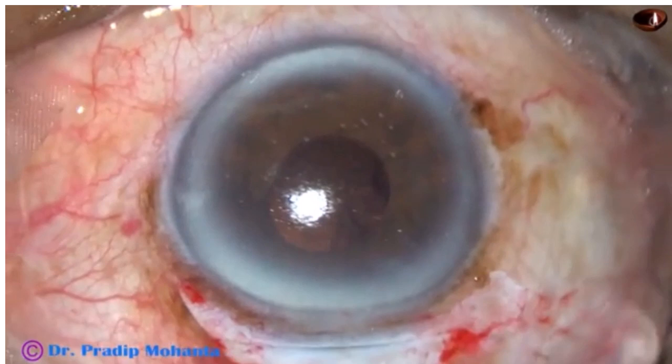So you see that there is no possibility of placing the posterior chamber IOL in the posterior chamber, that is the physiological position of the lens, because there is no bag. So in such a case, you either place an anterior chamber IOL or a sclerofixated IOL, both of which were not available decades ago when this technique was devised.